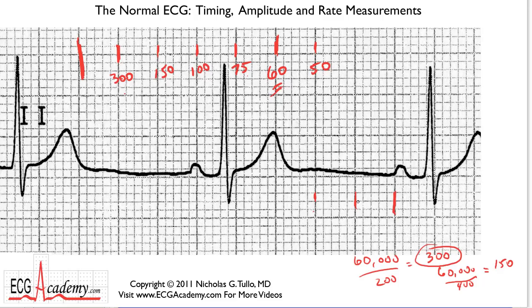What you do is start on a heavy line if you can, and then count in one direction or another looking for the next similar signal: 300, 150, 100, 75, 60, 50. You'll have to fudge it a little — if this is 60 and this is 50, then the heart rate must be just below 60, and you'd probably be okay to call it 58 beats per minute. That's a quick and easy way to figure out heart rate.